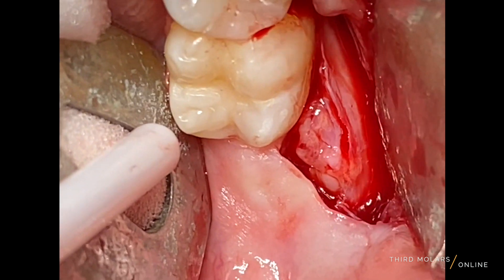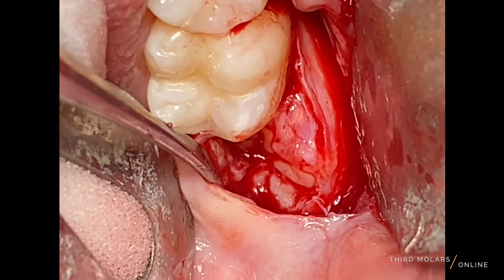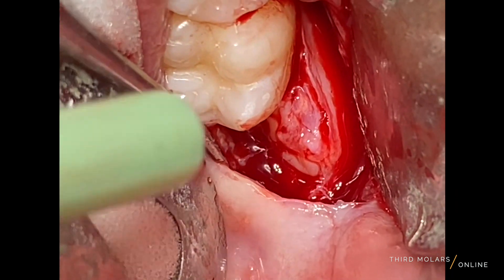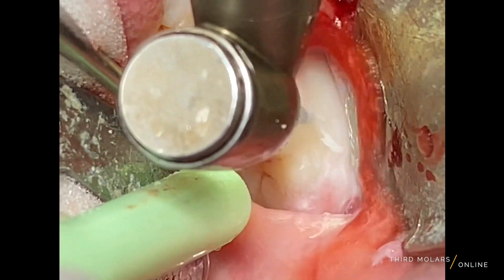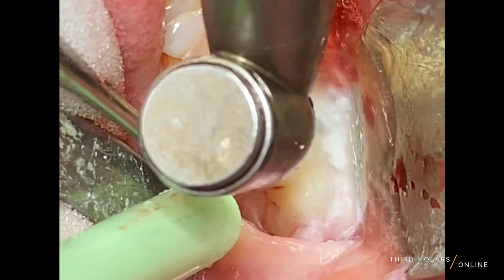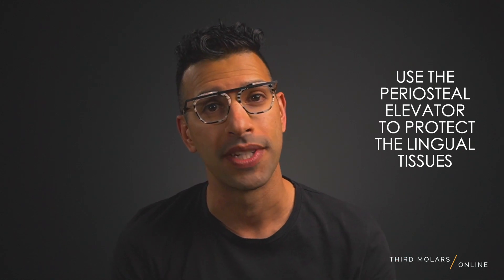Whenever you're using your handpiece, protect the lingual soft tissue anatomy with your periosteal elevator. Ask your dental assistant to hold the flap back so we don't have an inadvertent burr injury to that lingual nerve, which can happen if you're not careful. As you can see here, I always hold the lingual of my flap with my periosteal elevator and have my assistant hold it in position. Not only will this provide you with great access and visibility to the tooth you want to remove, but it also protects the lingual nerve.